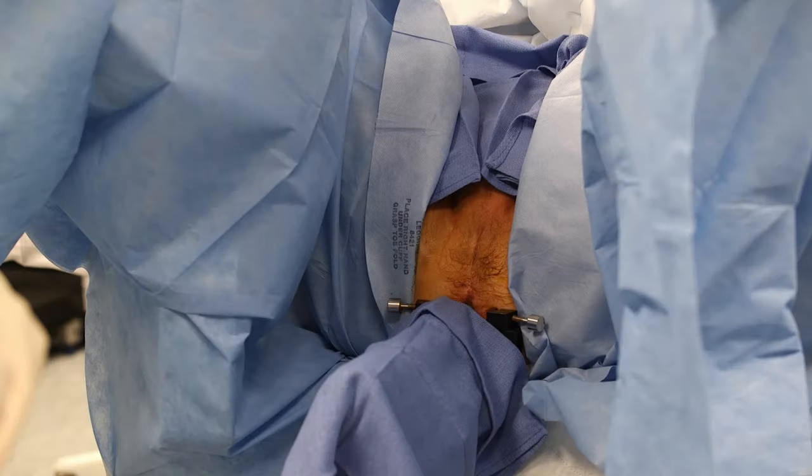The legs are draped with the cystoscopy pack and the suprapubic area is covered with a sterile blue towel. The ultrasound probe is also covered with a sterile blue towel. Local anesthesia is injected in three locations. First, the perineal subcutaneous tissue is injected with 10 cc's of 1% lidocaine.